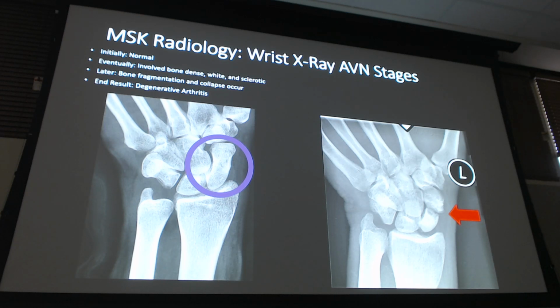So if we're looking at it, and we're following through the cortex, right? We're going through every single area of the x-ray, and just because we're looking at the scaphoid, don't forget, when you're reviewing these films, to look at every single bone that is on there, and follow that cortex and look for any of those breaks. Does anybody see any on the purple circle at the level yet where you're like, maybe something to watch for, not really sure? Use your computer instead of the PowerPoint. Sometimes it's a little bit easier for you guys to see because you can zoom, right? I'll give you just a second.